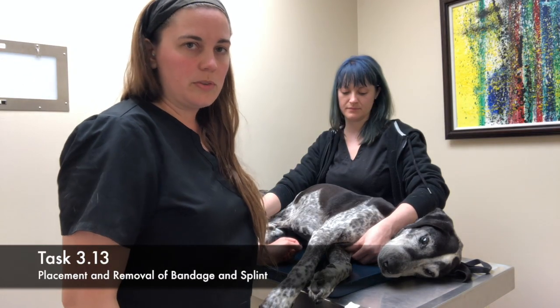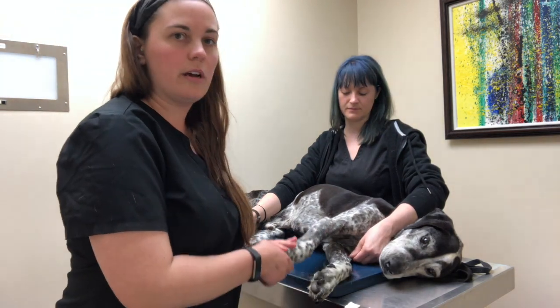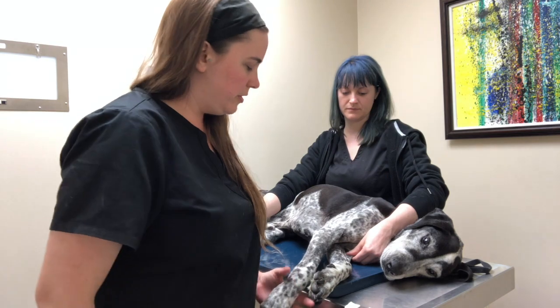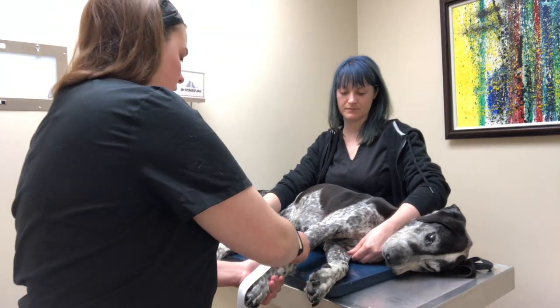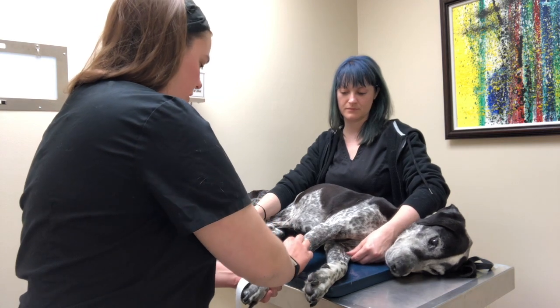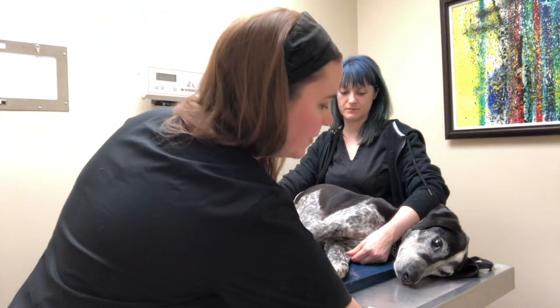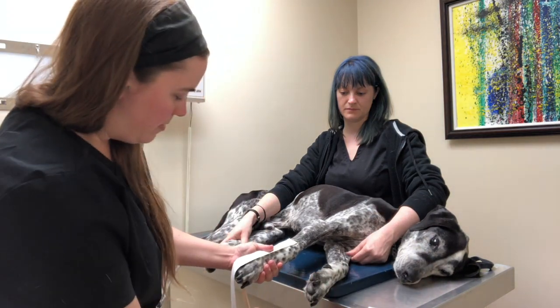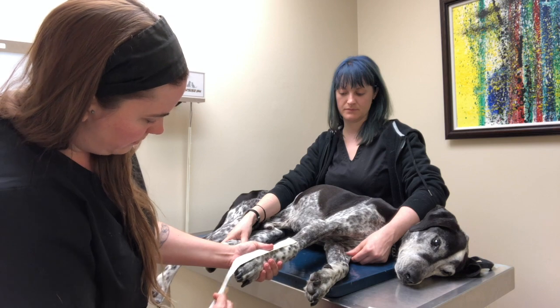A bona fide Robert Jones bandage is used to stabilize a fracture at the distal portion of a limb. So the first thing we want to do is place our stirrups. We want to put that on the distal third of our limb on both sides. We're going to use a tongue depressor to help keep our tape from sticking to itself and each other.